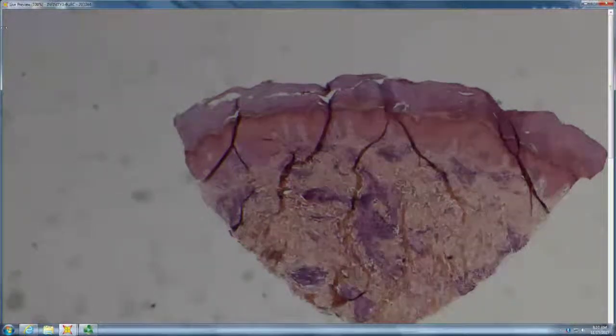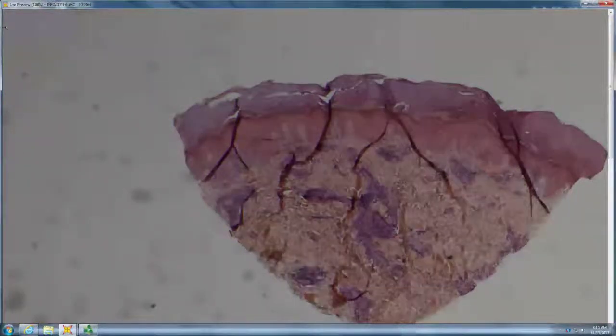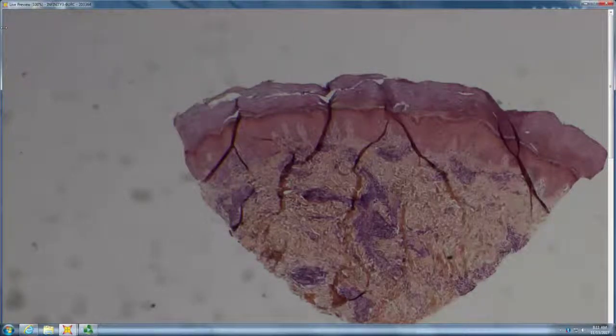This one's a little bit thick, quite acral. This is like a superficial infiltrate. So it's predominantly around what vessel? Looks like more of a capillaritis.